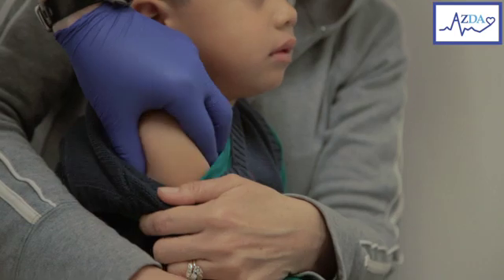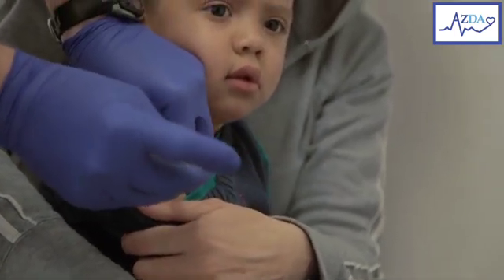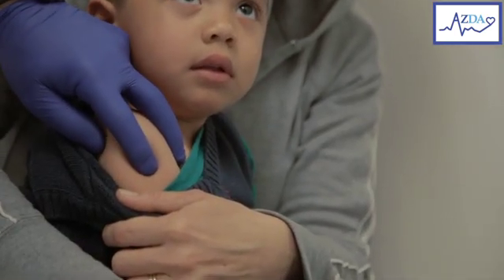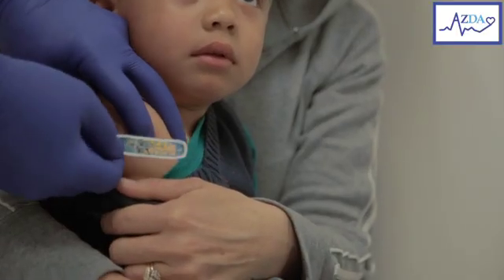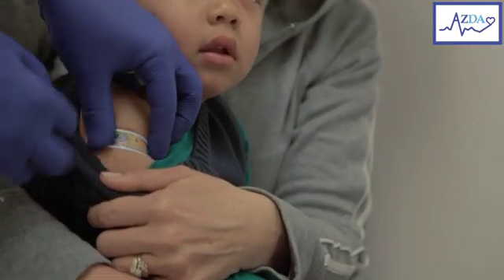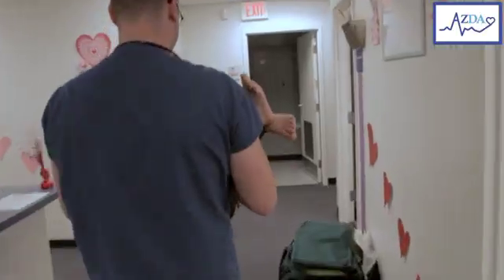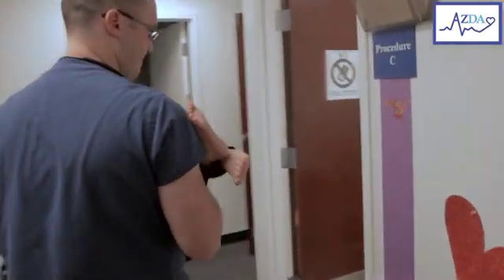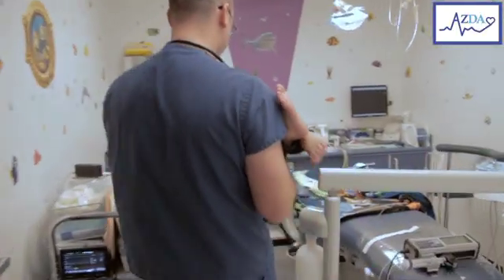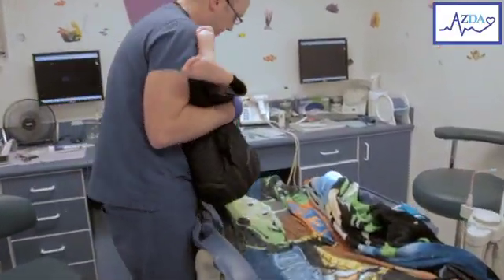What you're seeing here is an intramuscular injection. We should run these cases exactly like we would with an open airway case — don't change your dosages, just do your regular open airway technique. Most of you know that the ketamine cocktail takes two to three minutes to really start setting in. For time purposes, we've just skipped that portion of the video.